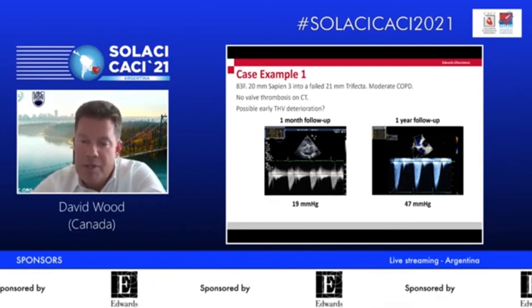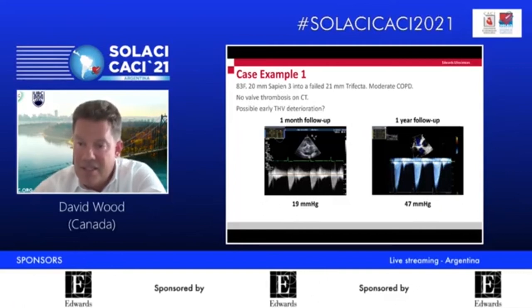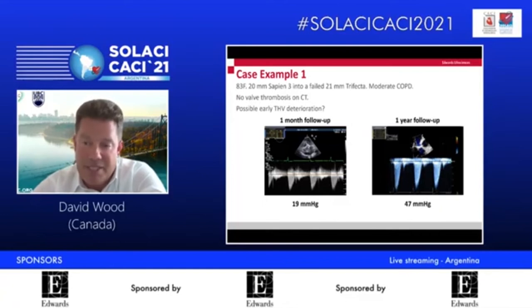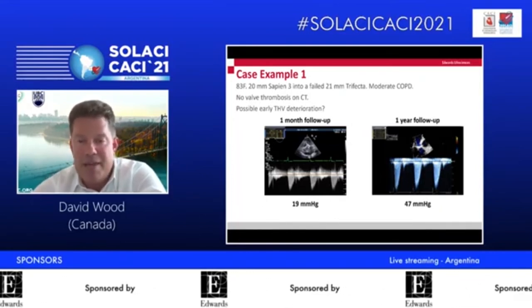And I'll be honest, at this point, John and I had gotten to a place where we were not doing on-table echoes, simultaneous on-table transthoracic echoes, on most patients. And we were not doing meticulous invasive gradients on most patients.